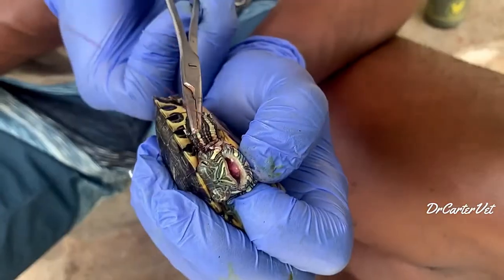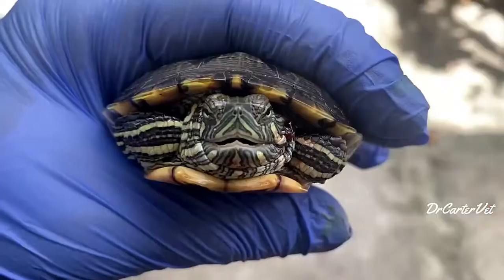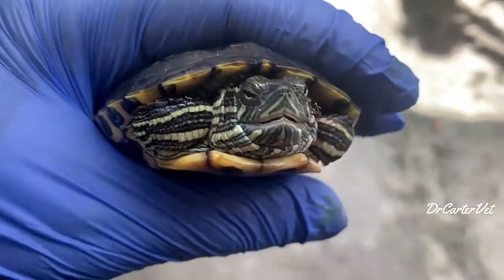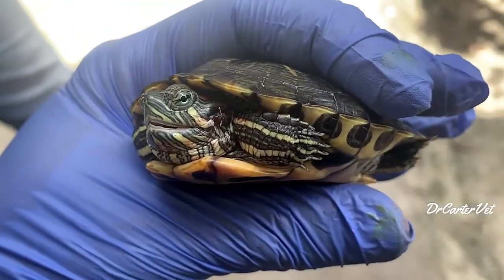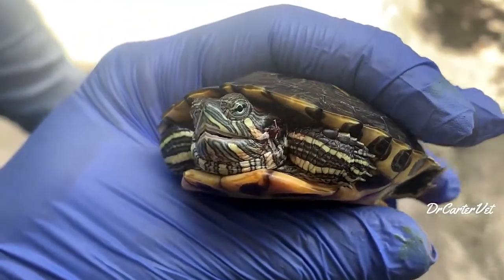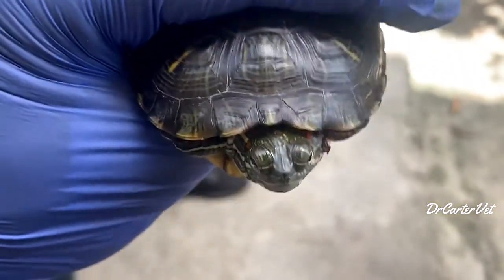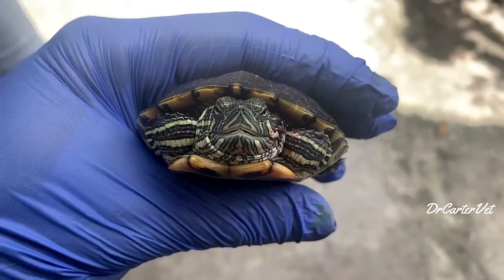I'm using absorbable sutures, so I don't have to remove them — but you could use sutures that require removal. Look here: if you compare the unaffected side and the affected side, they're almost the same. The quality of life of this animal increased significantly. I was very happy to be there and sort it out. It looks brand new again.